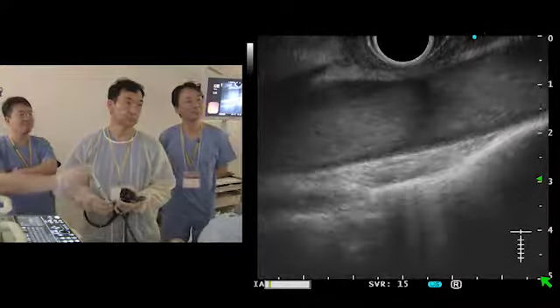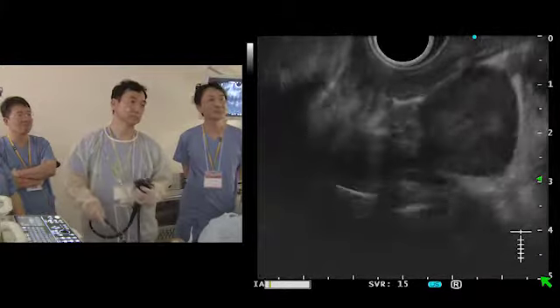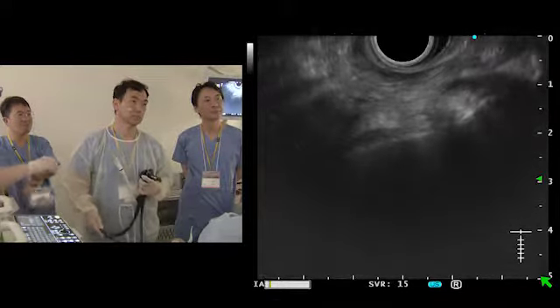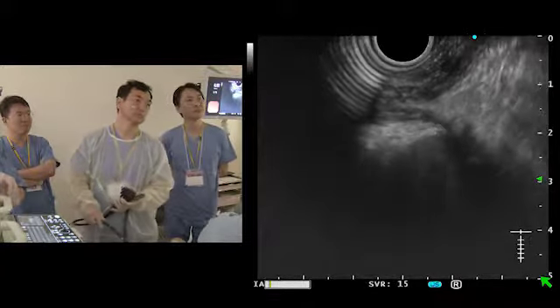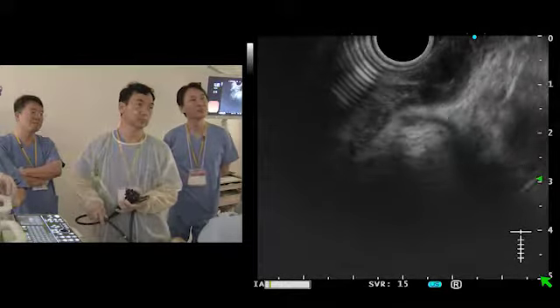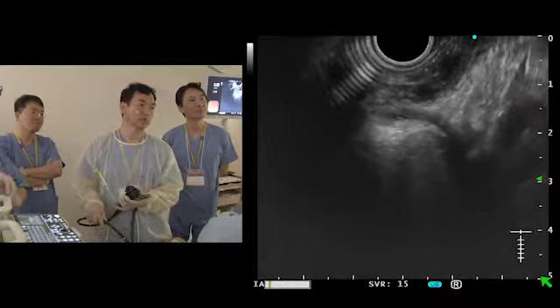If we approach surgically, we have two potential access routes. We have to confirm its position exactly by CT scan. But anyway, we can approach transhiatally or also thoracoscopically. But the first approach is, I think, endoscopic.